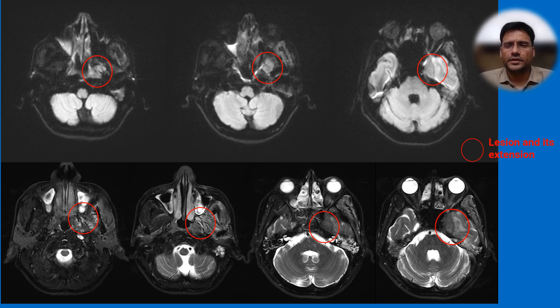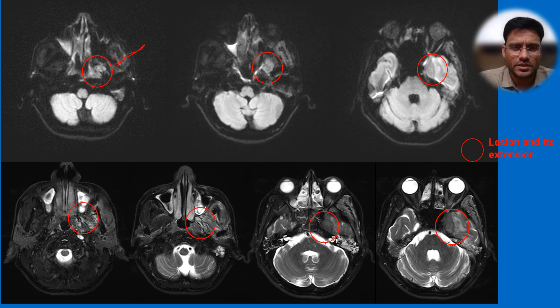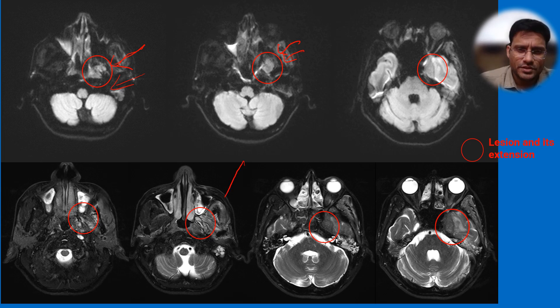Let me discuss the case for you. You are able to see a suspicious mass at the skull base and fossa of Rosenmüller. These images show a suspicious mass which is demonstrating diffusion restriction. The T2-weighted image shows the mass very well here. A lesion is also seen at the cavernous sinus and extending into the temporal lobe — you can see temporal lobe edema in this image.